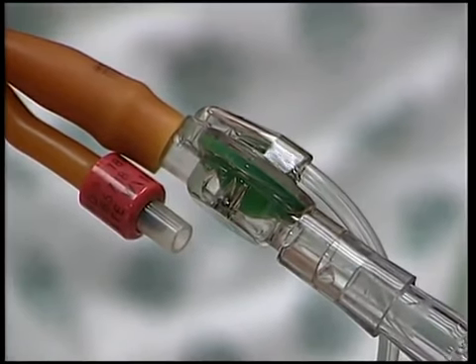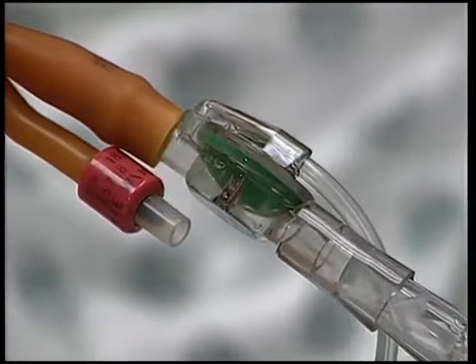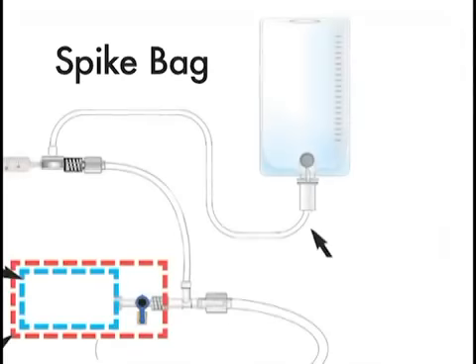After approximately 2 minutes, the diaphragm collapses and the valve automatically opens, allowing the injected saline to drain into the drain bag. The valve remains in this drain position until you infuse saline to obtain your next trending data point.